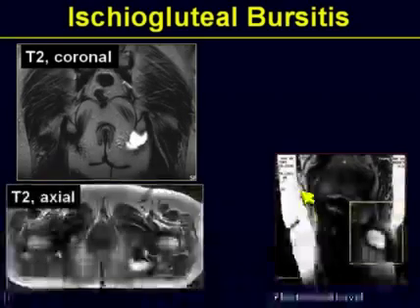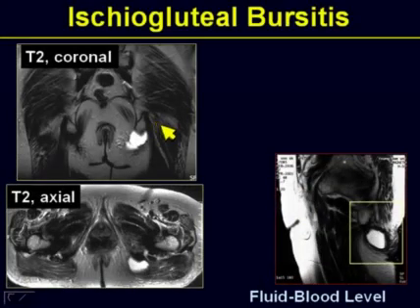So, on MRI imaging, if you look at the left hip of an individual, let's begin by taking a peek at the fluid-sensitive T2 image. You'll notice the unaffected ischial tuberosity on the right side, as we go over the patient's perineum onto the left side, that clearly there is a signal aberration unilateral to the left side. And as we jump to the actual imaging, the patient is lying down and you're looking at the patient from his or her feet. You'll notice the left-right comparison, there's a collection of fluid.